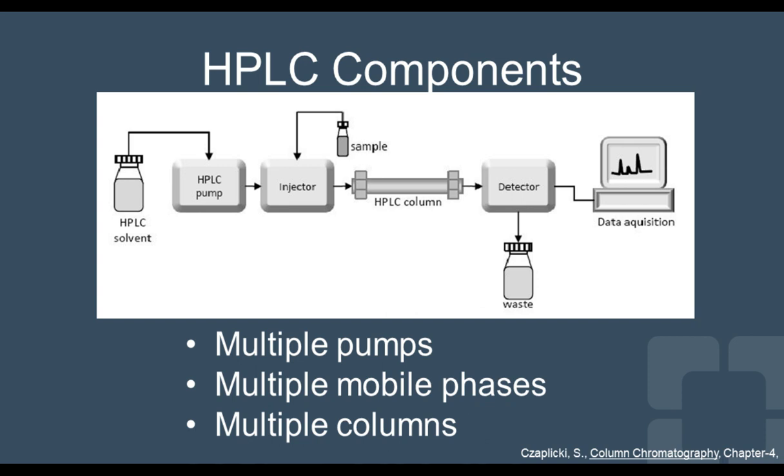Now this can become more and more complex. You can add on multiple pumps, as we discussed with binary systems, where you have multiple mobile phases, and you have multiple columns to achieve potentially the sensitivity or specificity that you need.